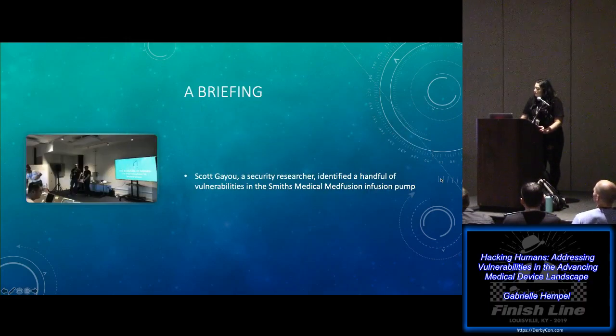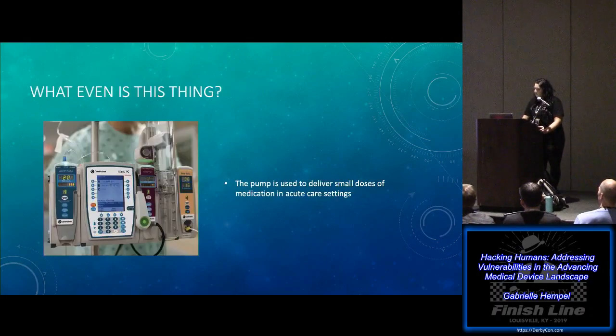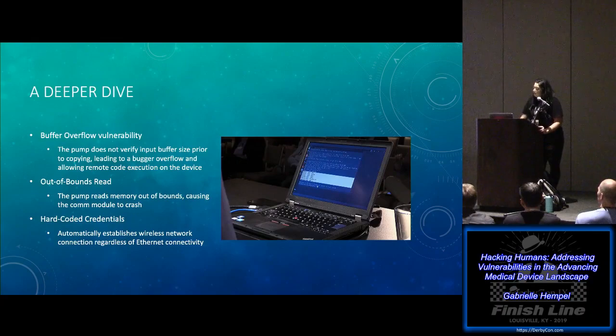Scott Gayu, a security researcher, identified a handful of vulnerabilities in this MedFusion infusion pump. In short, the pumps are used to deliver small doses of medication in acute care settings. A third-party component in this pump did not verify the buffer input size prior to copying, leading to a buffer overflow and allowing remote code execution on the target device. While a difficult exploitation, it was potentially extremely malicious.